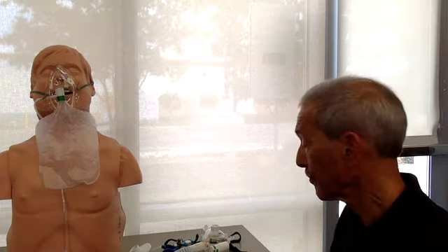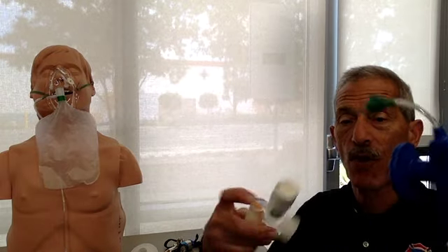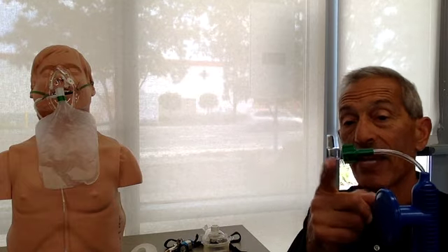So because he's awake and alert and talking to you, and he's breathing on his own somewhat effectively, he's good for probably CPAP. Now, you're going to open up the packaging and you're going to pull out the tubing. And the tubing is pretty straightforward. There are 2 ends, like most tubings. This is the end that attaches to your regulator.